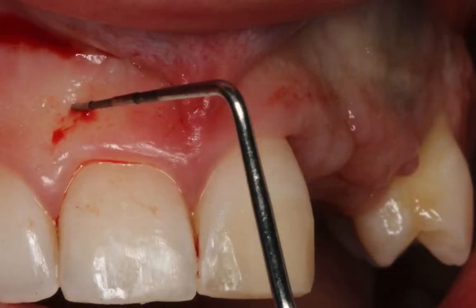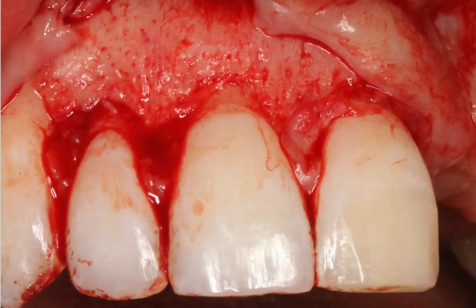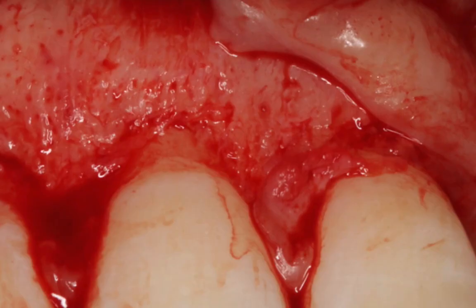So really the first step is to decide on the most apical extent of your incision, your first gingivectomy incision, where you resect soft tissue to match the adjacent tooth. And now we can see that by creating this gingivectomy, we're actually still on enamel, which is a really good sign. The step after that is a full thickness flap beyond the mucogingival junction to assess what is the bone underneath. And what we can see is that the bone is relatively close to the CEJ.